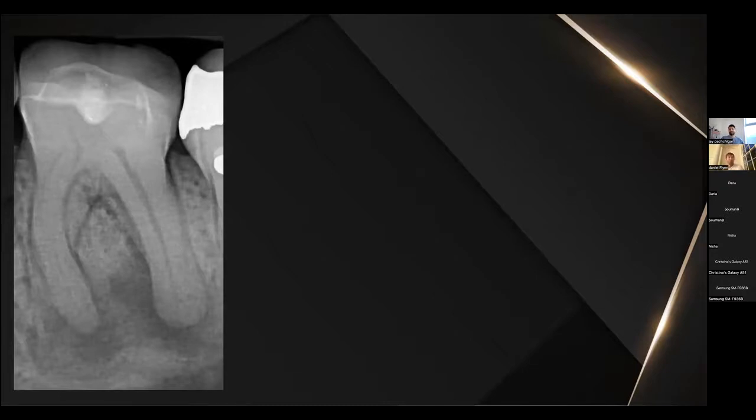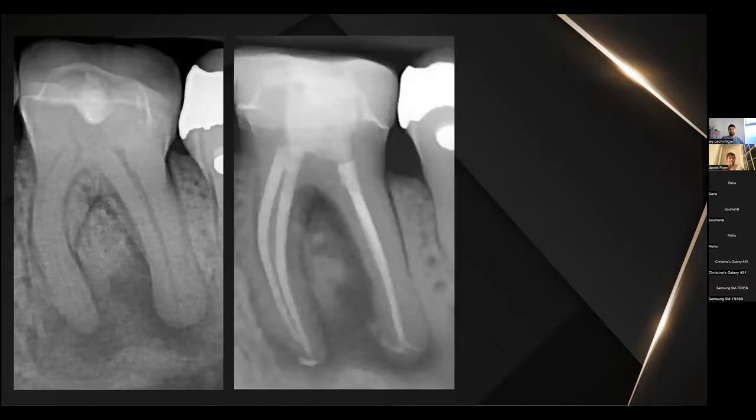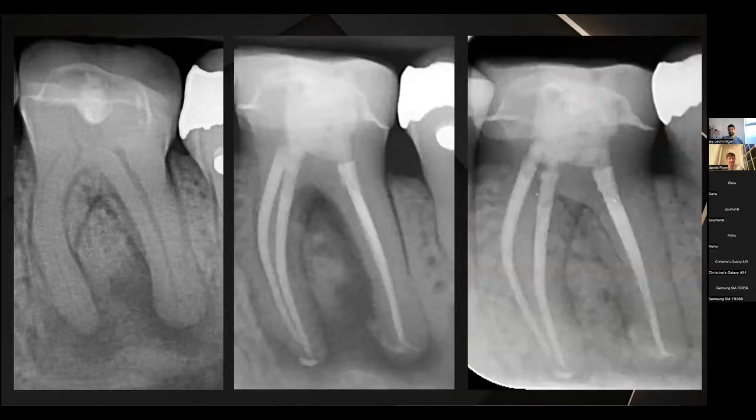Where you've got these big existing lesions, there's going to be a high bacterial load in these areas, and if you do seal these areas with your sealer, ideally you want them to stay that way. It's a bit fuzzy on the post-op, but you'll see this little bit of sealer is still there, making sure these apical areas are completely sealed the whole time.